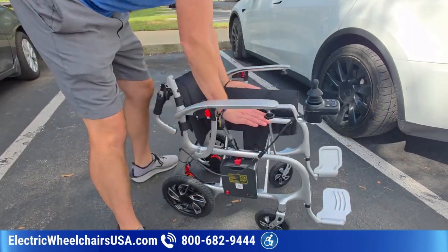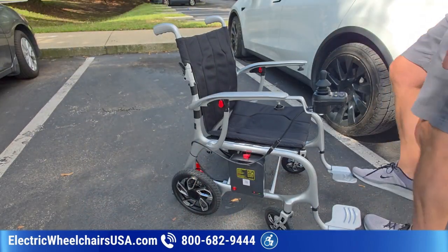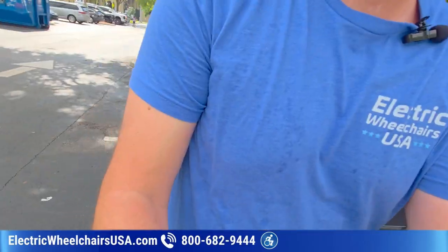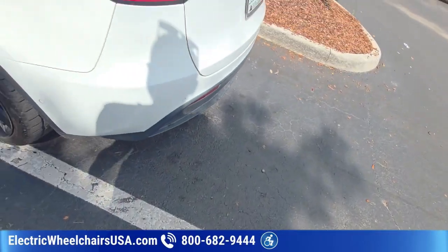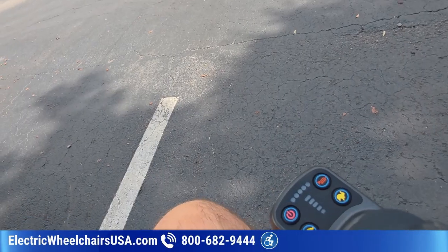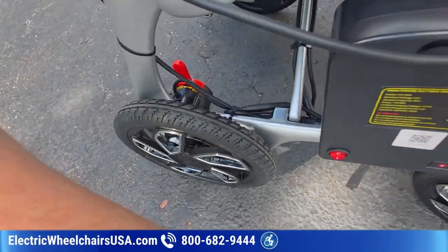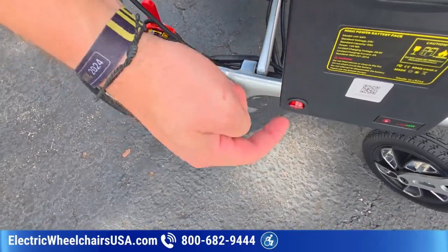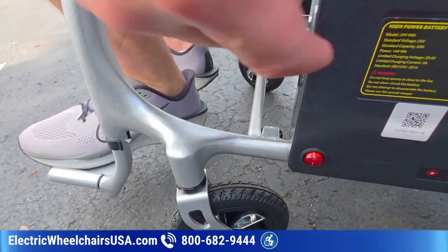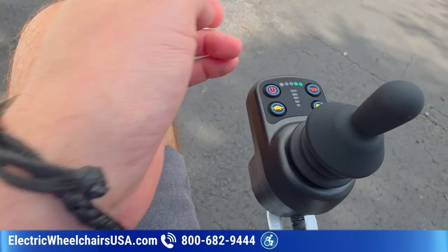So again, just going to push down here, put the seat back up, put the footrest down, and we'll take it for a little spin. I'm actually going to get into the shade because it is hot out right now. So power it on. Oh, actually, I can't power it on because the batteries aren't turned on. So let me flip the batteries on. This is an important step. You don't have to do it on both of them, but I'll do it on each side. Now that I've done that, I can power this on.